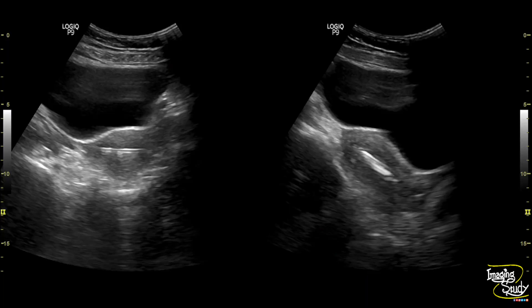Here's a picture of a normal intrauterine contraceptive device location. You can see the vertical part is well visualized in longitudinal section, but the horizontal part is best seen when you check the transverse section of the uterus at the level of the body. This horizontal part should be seen at the upper part.